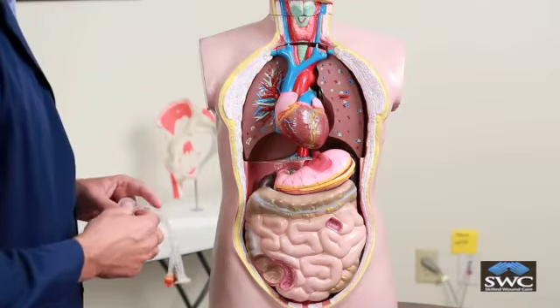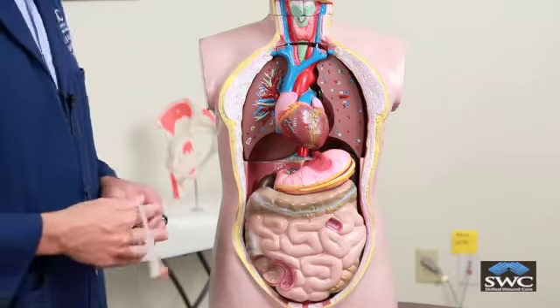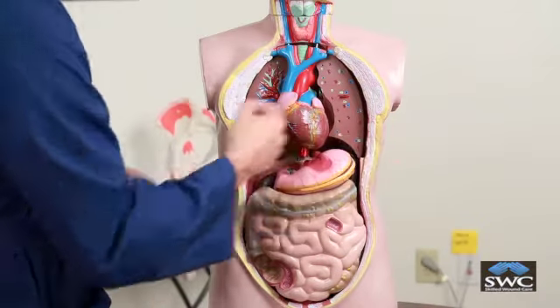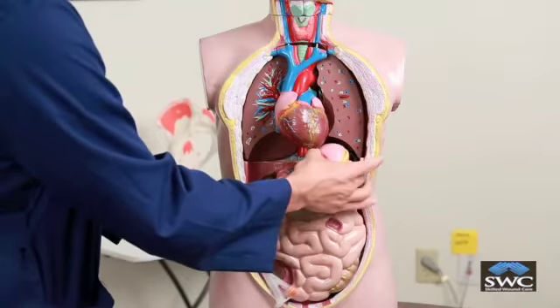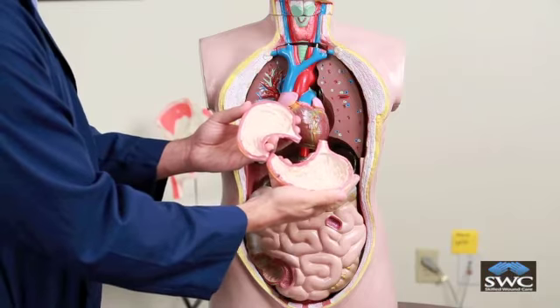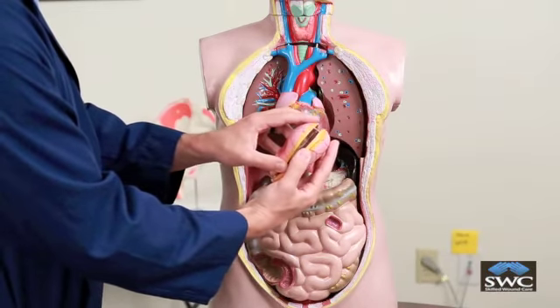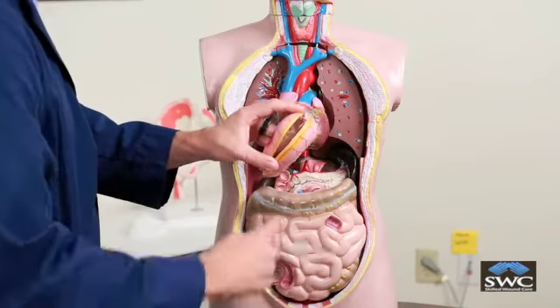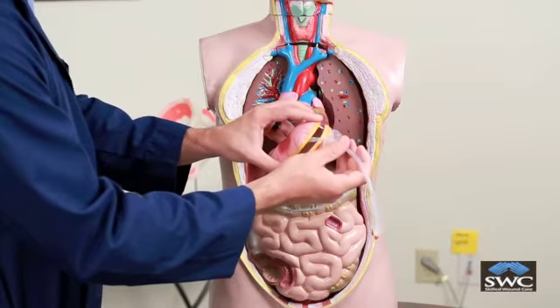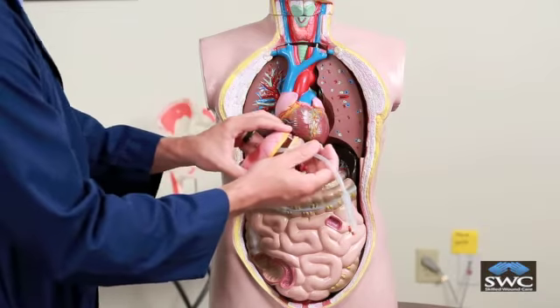A lot of times we see patients and get referred for what is known as peristomal dermatitis, and it could be a fungal rash. It usually has to do with the acidic contents of the stomach leaking out. When we look inside the stomach, what we have are rugae. As the patient is fed, the orifice where the gastrostomy tube is opens up, and we note the leakage coming around the outside of it, and we get the peristomal dermatitis, which can be very uncomfortable for the patient.